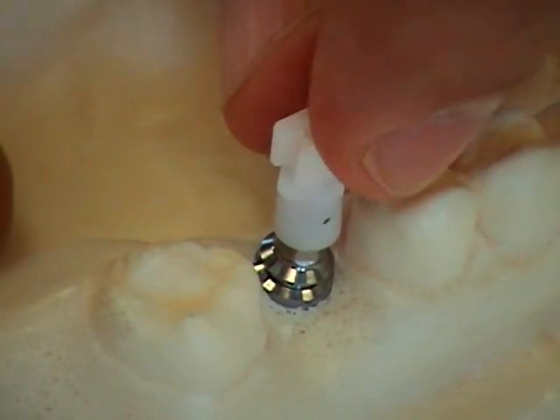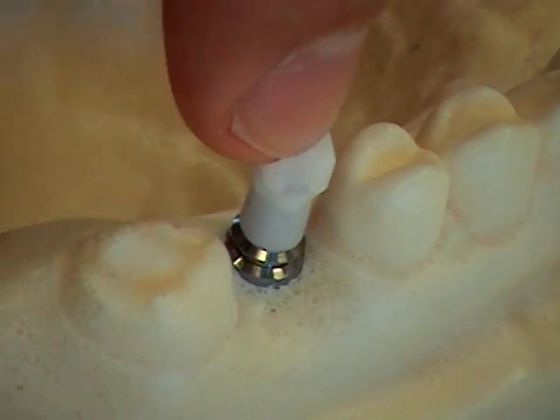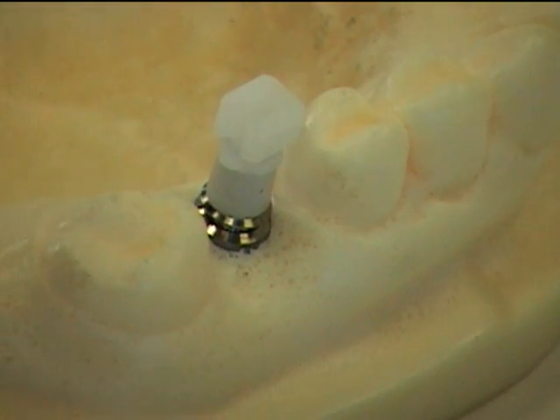Therefore, it will only fit in one direction. You seat it gently first, and then spin it until the flat sides line up, and you'll find that it drops into place and remains there. Now it's in place, and we're ready to take the impression.